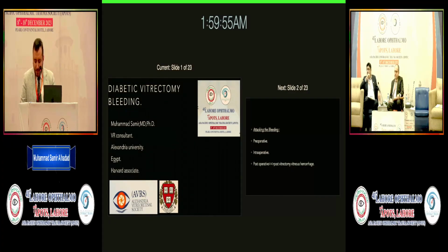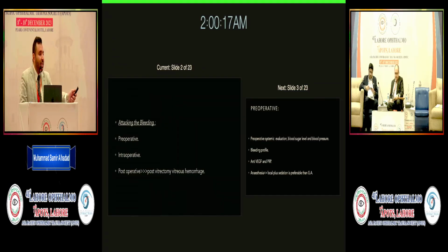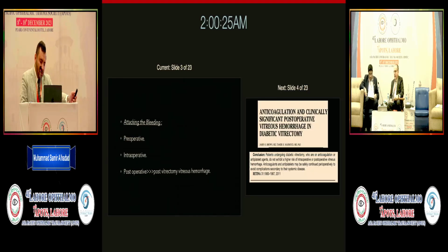Bismillah ar-Rahman ar-Rahim. I will be talking about a very common problem for each of us working in vitreoretinal surgery, which is diabetic vitrectomy bleeding. How to attack this bleeding, how to stop it, how to solve it and be prophylactic against it. First of all, attacking the bleeding can be preoperative, intraoperative or post-operative, which is post-vitrectomy vitreous hemorrhage.